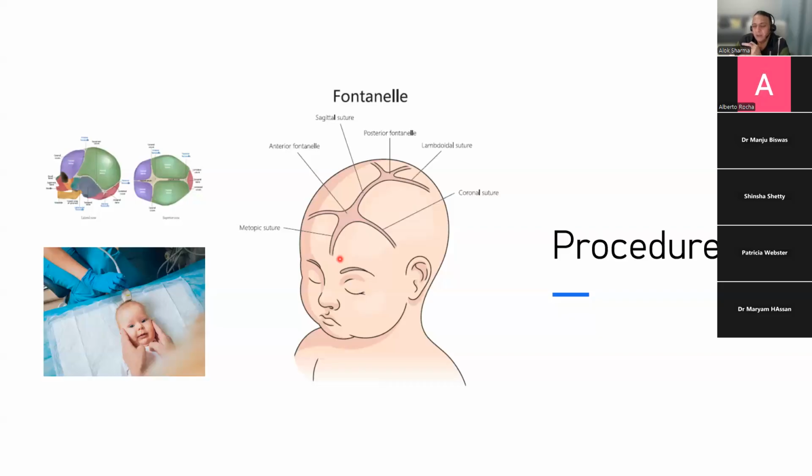for somebody who's not done cranial ultrasound, when he looks at the image, to say, well, where do I start? There's so much to see over here. So again, we've got an aide-mémoire that works on that, and that'll be part of one of our sessions coming up.